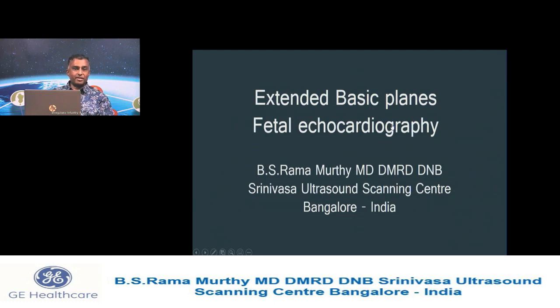A very good evening, friends. Thanks, Mr. Madan, for that introduction. In the next 1 hour or so, we'll try to look at the fetal heart, what is expected of us to assess the fetal heart when we do a mid-trimester anomaly scan.